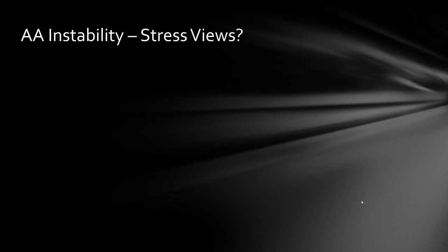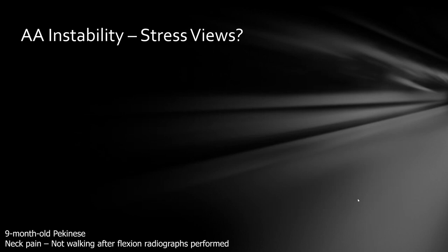So if you're worried about atlantoaxial instability, but your survey radiographs are equivocal, should you be doing stress views? My very strong opinion is no. I would strongly advise against it. Stress views meaning, should we flex the neck to demonstrate instability?